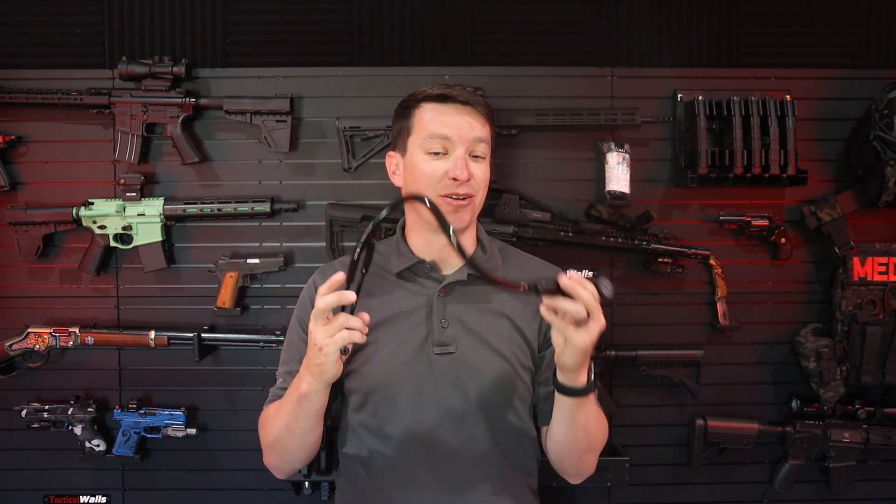Welcome to another video. In this week's video, we're going to be doing a product review. Unfortunately, it's not on any of the super cool toys behind me, but it is definitely something useful in an emergency situation, whether you're a layperson, just a civilian, or a professional EMT, paramedic, nurse, whatever. It's a stethoscope, and this is my first one that actually comes with software.